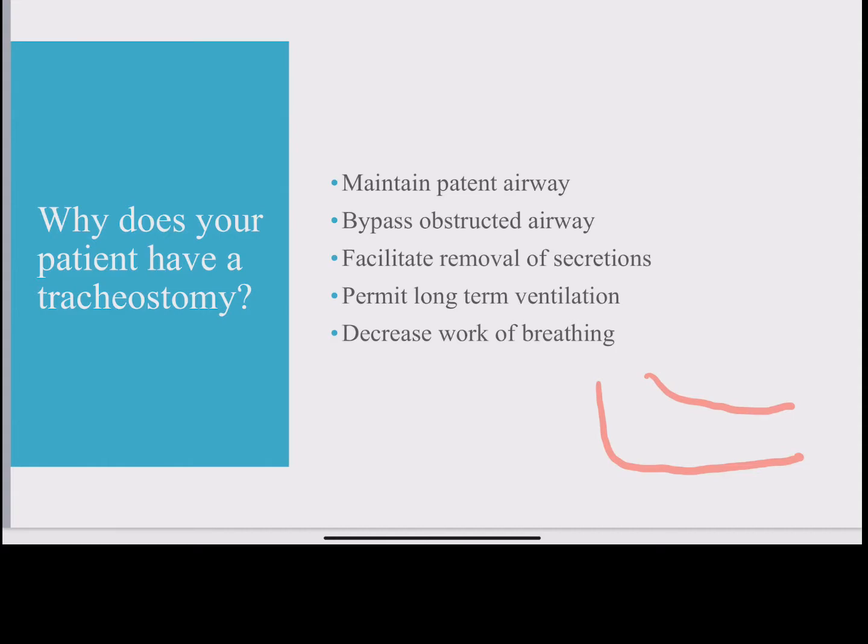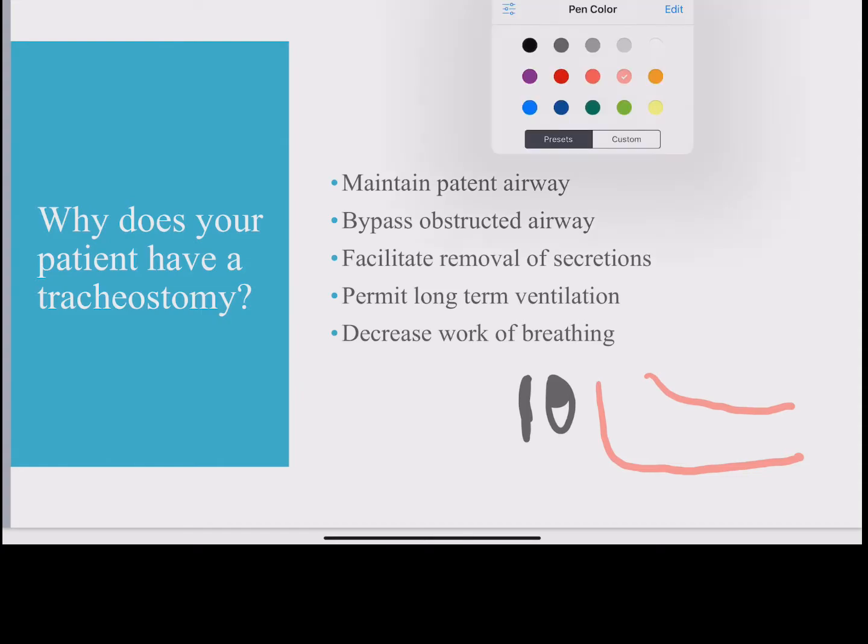So here's our patient laying down. There's little eyebrows, eyes. And here is the actual ET tube.